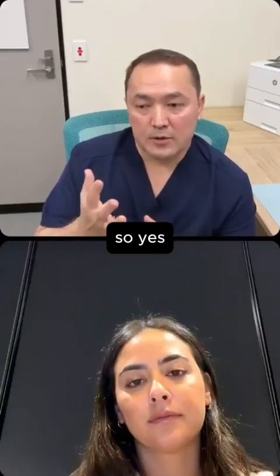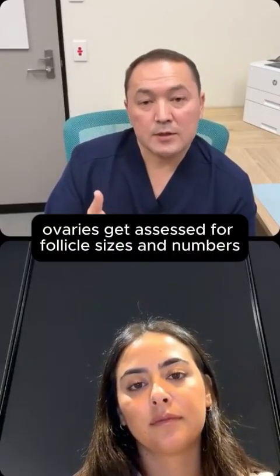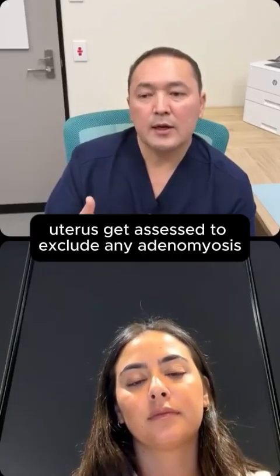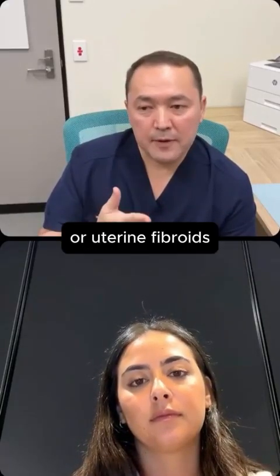So yes, the ovaries get assessed for follicle sizes and numbers. The uterus gets assessed to exclude any adenomyosis or uterine fibroids.